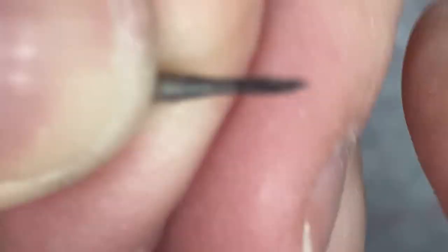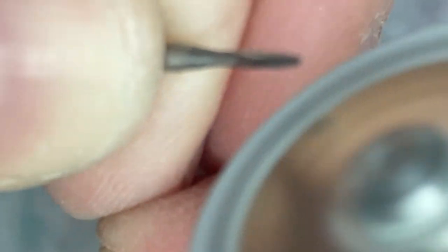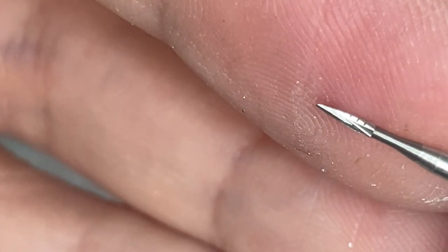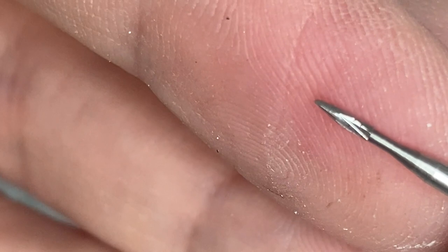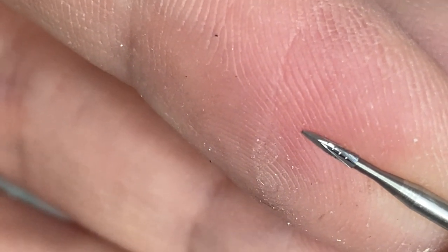Grind each side until you make the burr into a needle shape. Now you've got the needle burr. Just make sure it's straight — not lopsided — because then you wouldn't be able to grind straight lines with it.